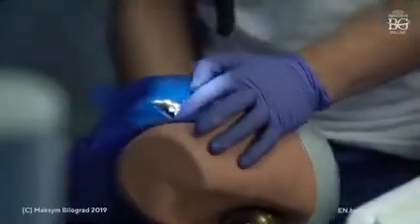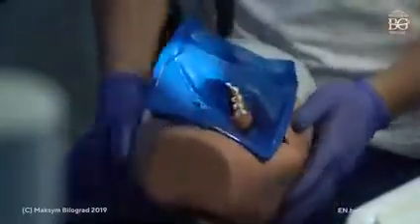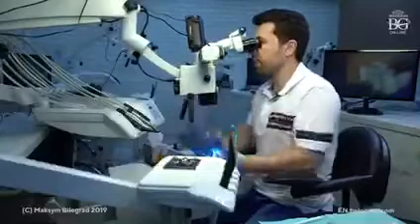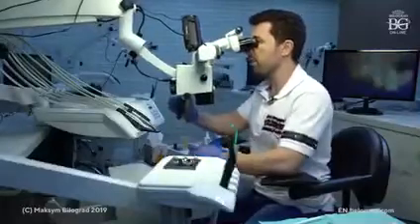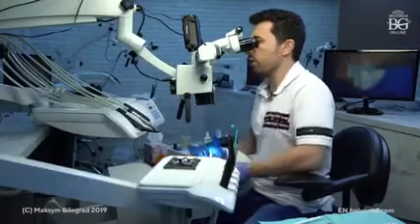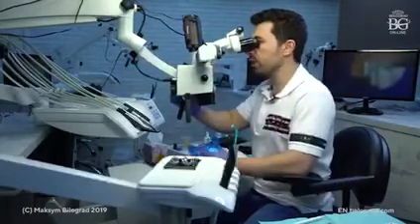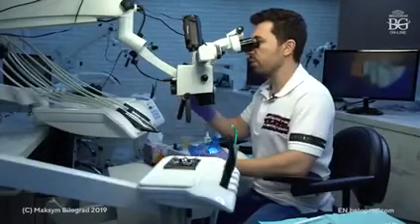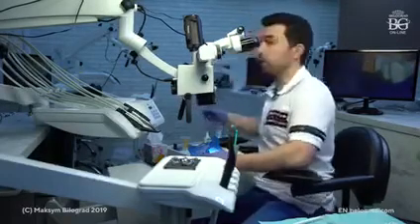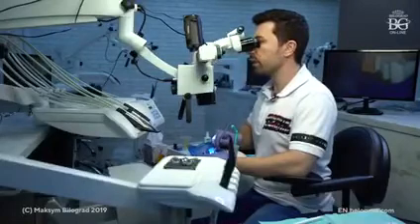Okay, turn the head of my patient this way, and we will be able to observe if the space that we create is enough for our dental technician. I would like to remind you that we used depth cutting burr 0.4. So you can take a periodontal probe and you can measure. This one is 1 millimeter.